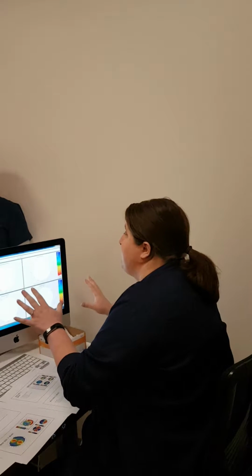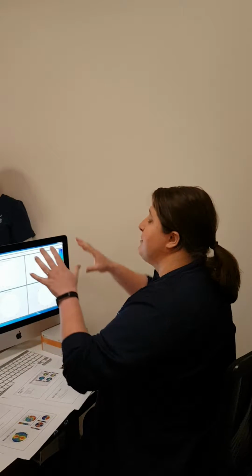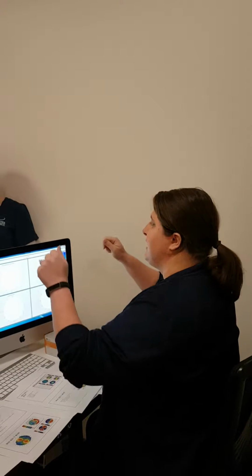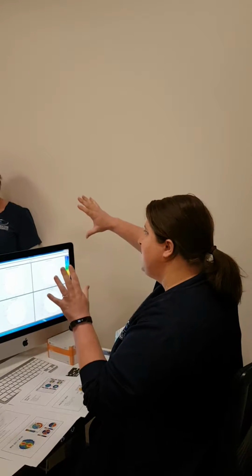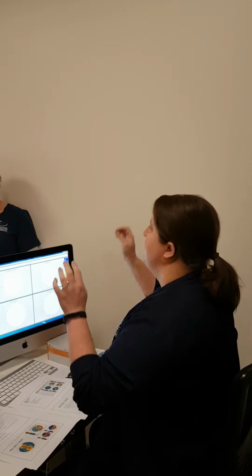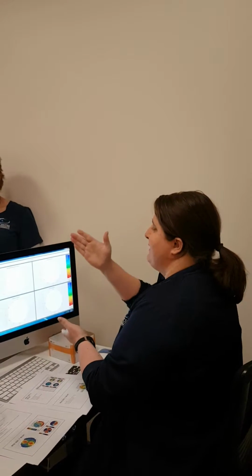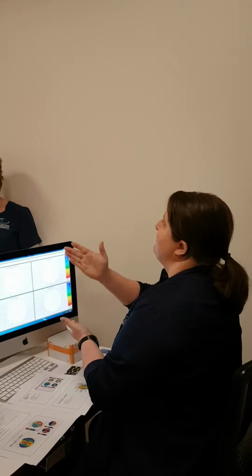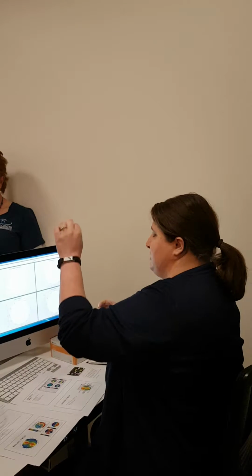Most of the time, I don't know if I've ever seen that. Every other time, you're going to get some irregular astigmatism, and the doctor's going to try to slowly remove sutures. Say the cornea is really tight this way, we're going to remove sutures to try to flatten it out, make it more round, okay? Which is why we do Pentacams for PKP patients every time they come in, so the doctor can say, oh, it's moved, now I can remove these 2 sutures.